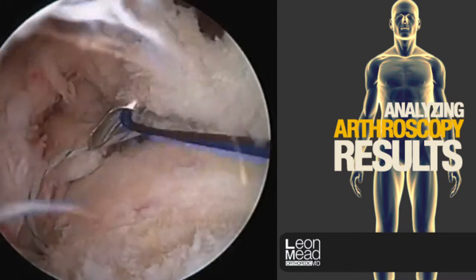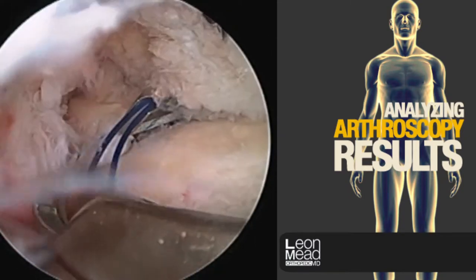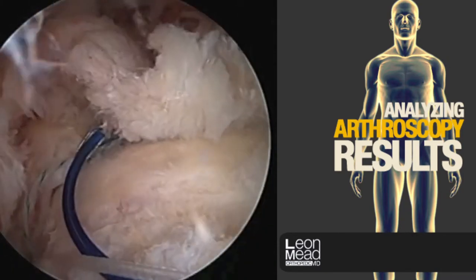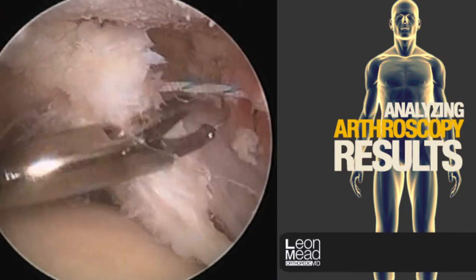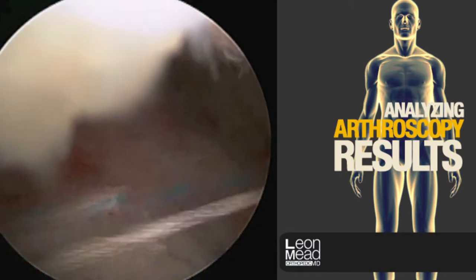One of the advantages of arthroscopic visualization is that we see much better than can be done in an open fashion. It is clearly superior for visualizing how the cuff mechanics work and how it's supposed to be repaired. Here we're grasping the sutures that we've passed.